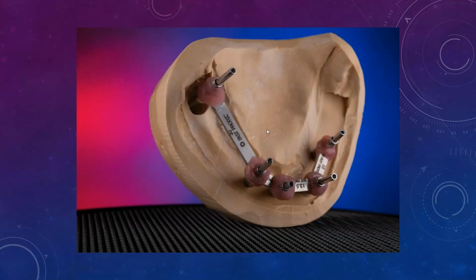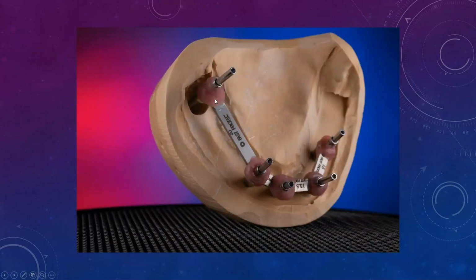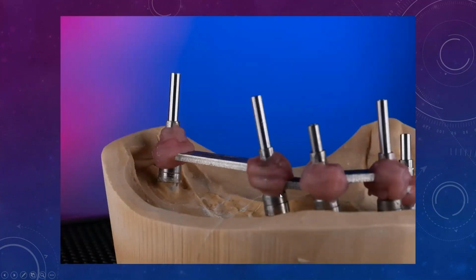I will take that area on the stone model and I'll grind it completely out. I'll make sure that all the components are screwed in properly. And from there, I'll mix up the same stone. I'm using low expansion die stone. In this case, I'm using GC IMP stone. It has an expansion rate of 0.08%, so very low expansion. It's a very nice stone.